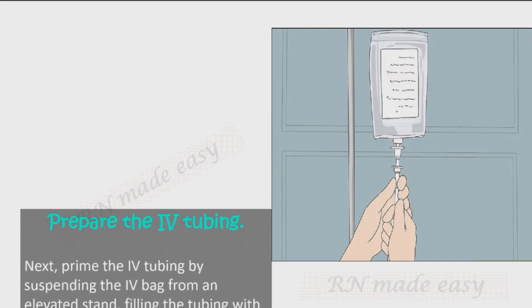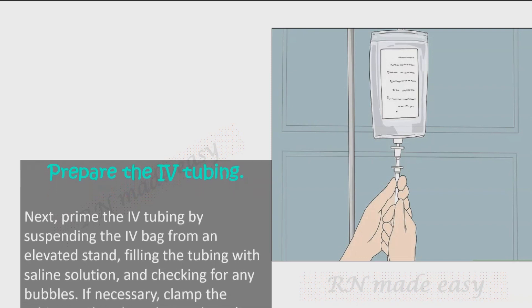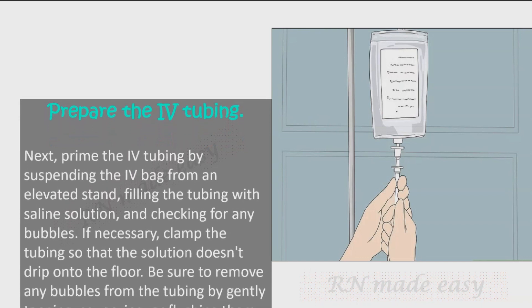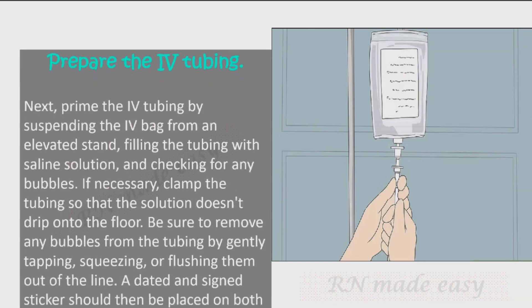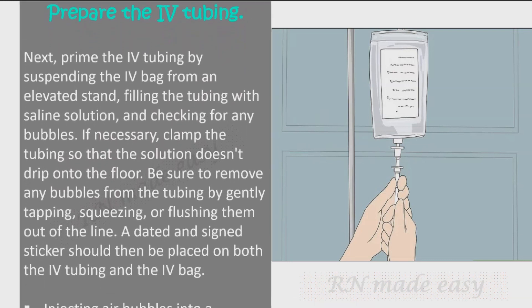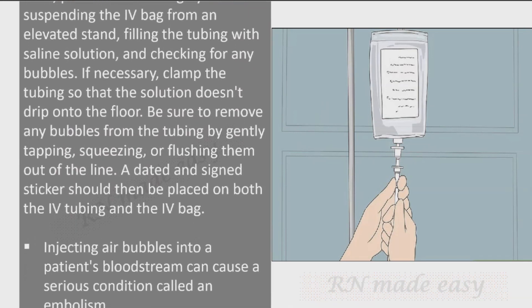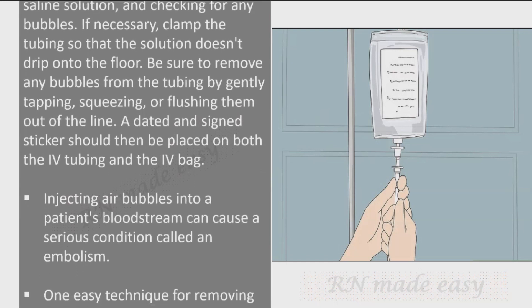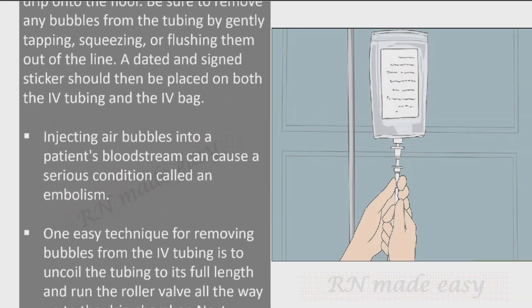Next, prime the IV tubing by suspending the IV bag from an elevated stand, filling the tubing with saline solution, and checking for any bubbles. If necessary, clamp the tubing so that solution doesn't drip onto the floor. Remove any bubbles by gently tapping, squeezing, or flushing them out. A dated and signed sticker should then be placed on both the IV tubing and the IV bag.